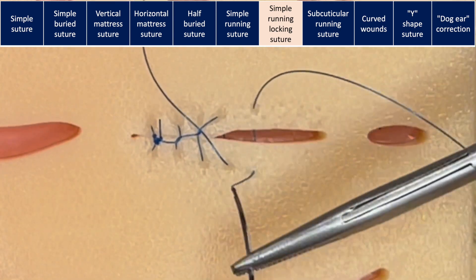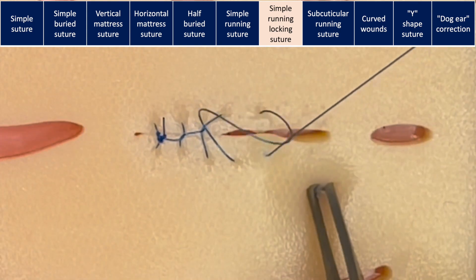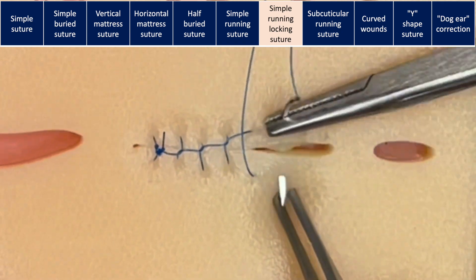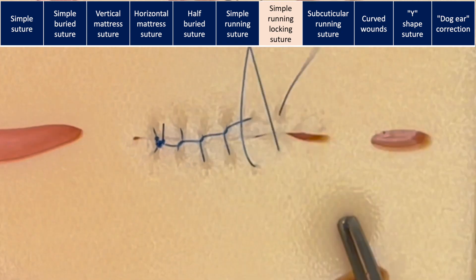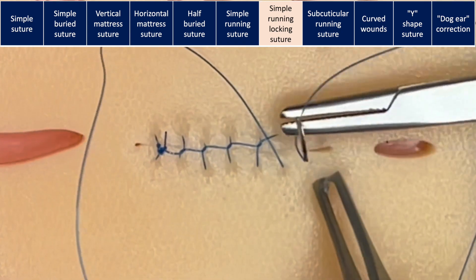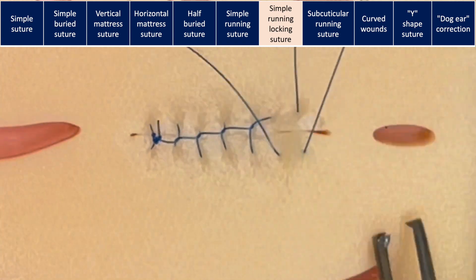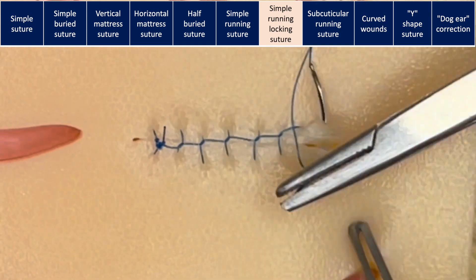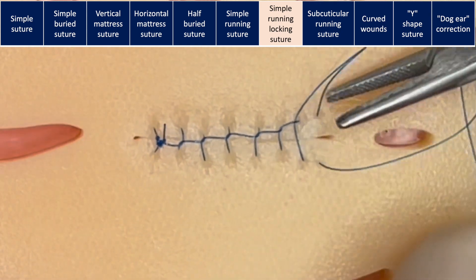Make sure it comes back through the loop. This suture is useful when you need to control bleeding — for example, when you have incisions in the scalp. At the end of the suture, you can finish by grabbing the loop and doing your instrument tie.